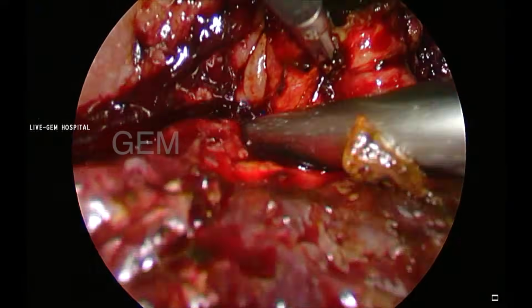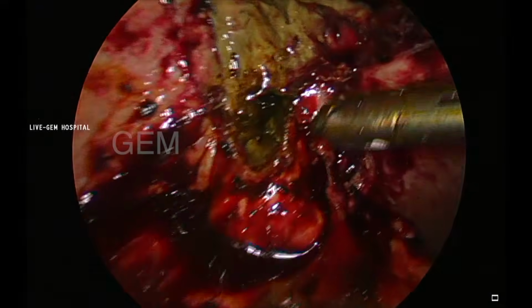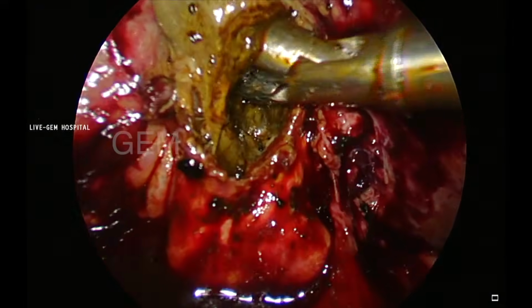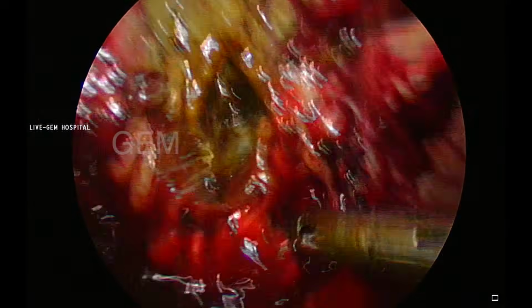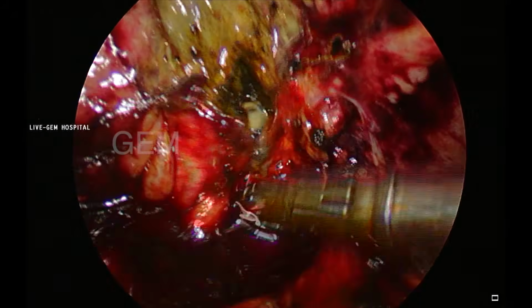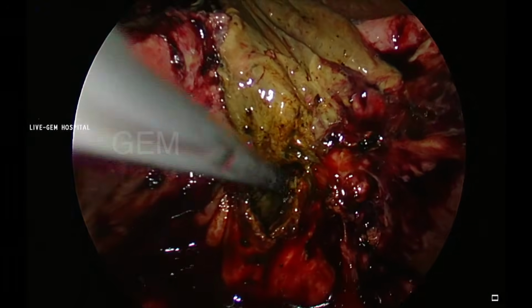So a subtotal is a well accepted procedure. The only thing is you have to clear all the stone, remove all the mucosa, and the infundibulum has to be sutured very nicely without any bile leak. So these are the criteria if you follow a subtotal. And in the infundibulum, you should not leave a long stump. It should be a very small pouch.